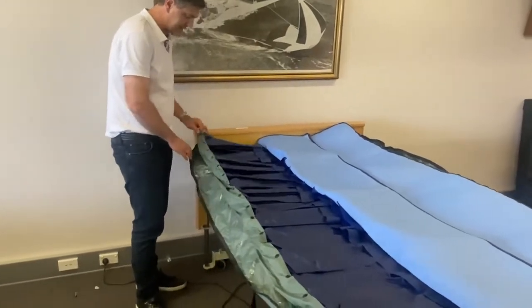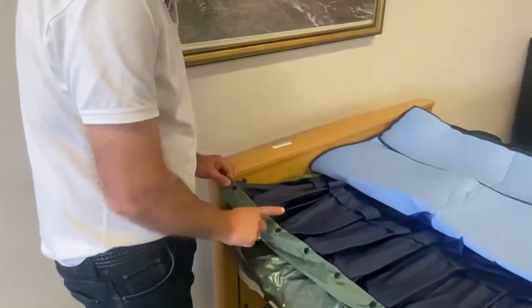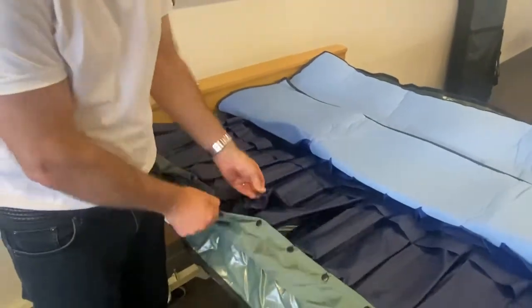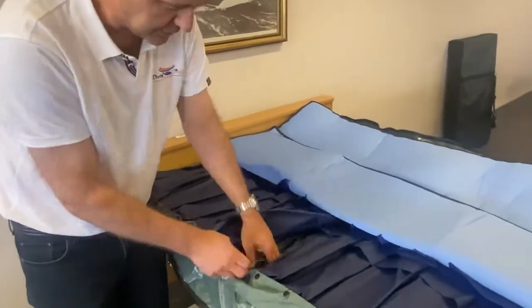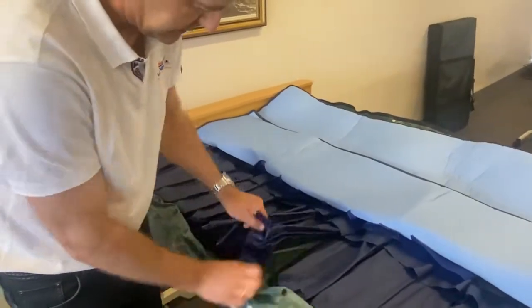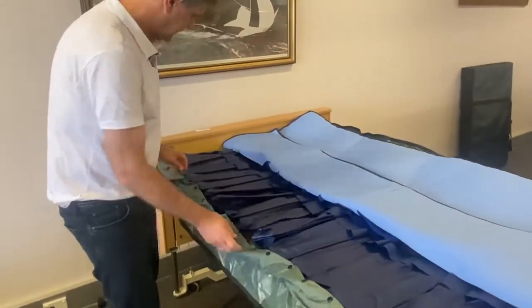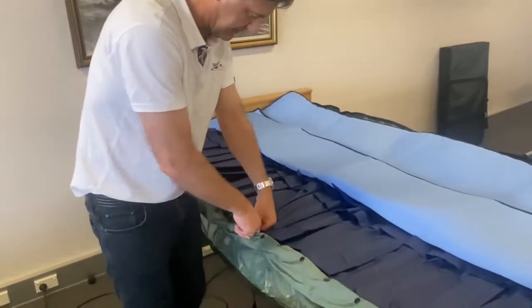Okay, now you go to the head end. The head cell is head cell number 1. So you count down from the head cell, 1, 2, 3, 4, 5, 6. And the 6th cell we unclip. We unclip 6 cells down from there, both the bottom and the top. So we do that. So that should be 1, 2, 3, 4, 5, one more, 6.